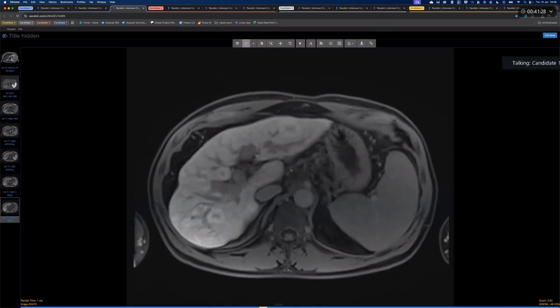So I would like to compare with previous, correlate with the patient's history for any high levels of alpha-fetoprotein and advise for image-guided biopsy. Or if we proceed for the Primovist scan, then these are not going to show uptake, and this will be satisfactory given the liver cirrhosis and the clinical presentation. Then I would like to refer the patient to the hepatobiliary team for further management and follow-up, staging CT chest, abdomen, pelvis, and follow-up.